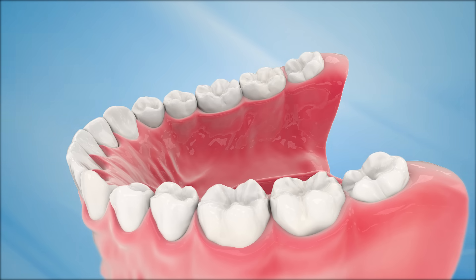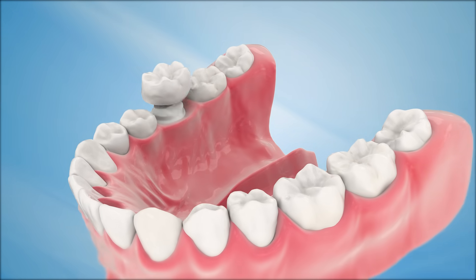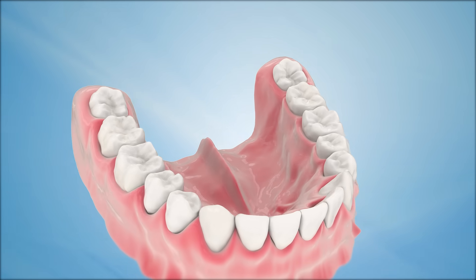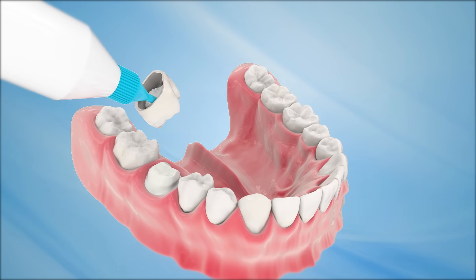During the second visit to the dentist, the tooth and gum tissue are numbed. The temporary crown is removed and the customized, permanent dental crown is checked for fit. It is then cemented into place with a special adhesive.